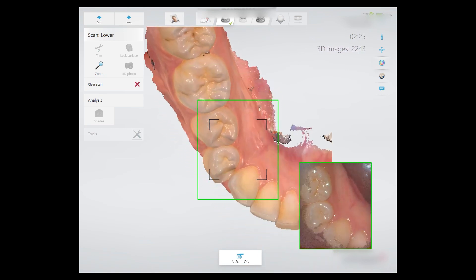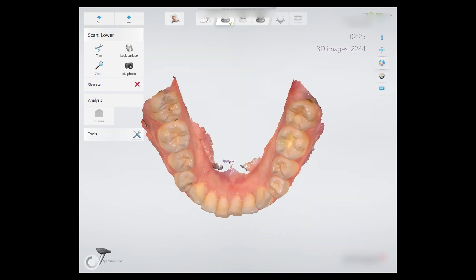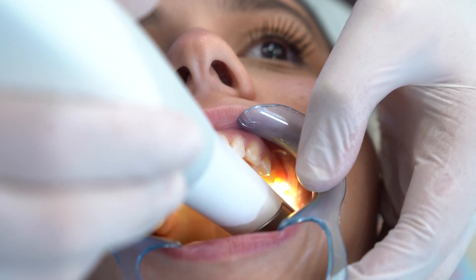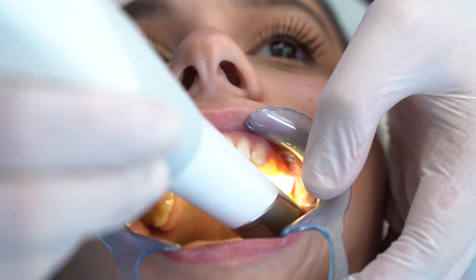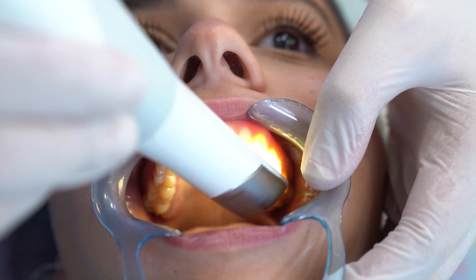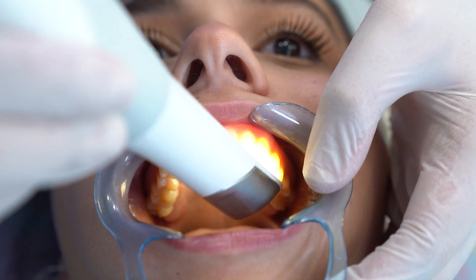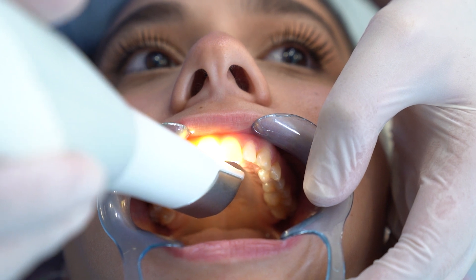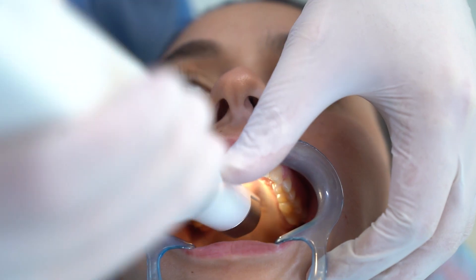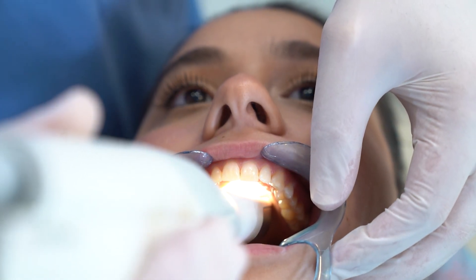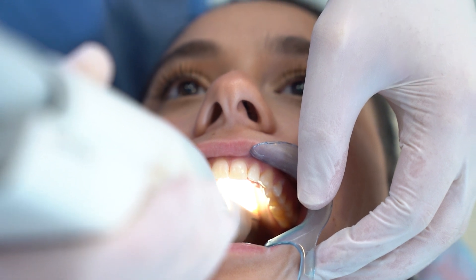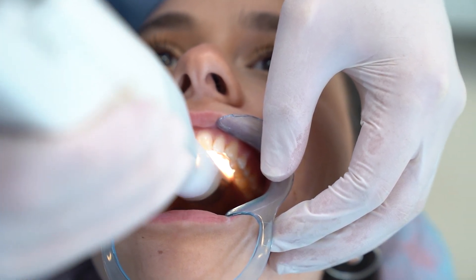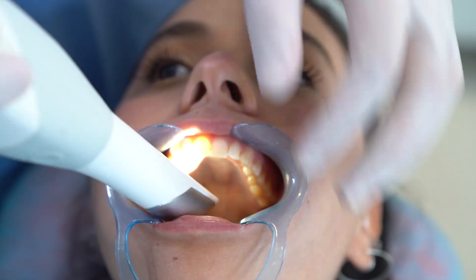The same scanning sequence can be used for the upper arch, although some scanner manufacturers recommend scanning the buccal surface before the lingual for the upper arch. Make sure you scan the palate by starting from the rugae area and then rolling right and left as you go posteriorly toward the soft palate.